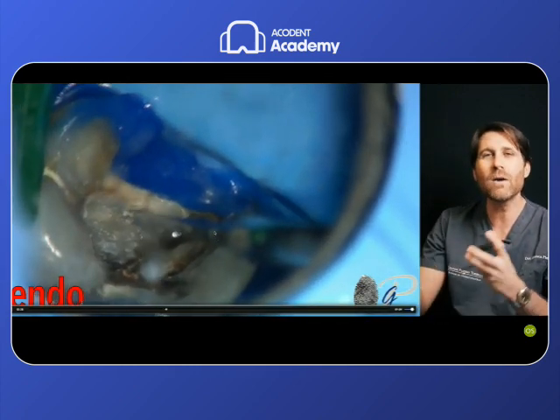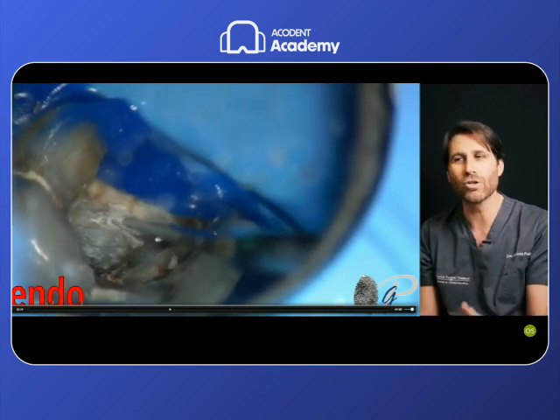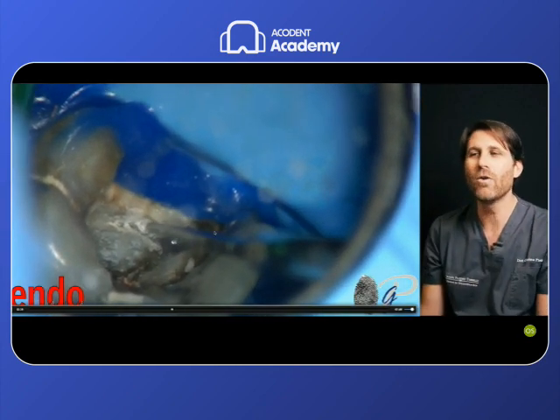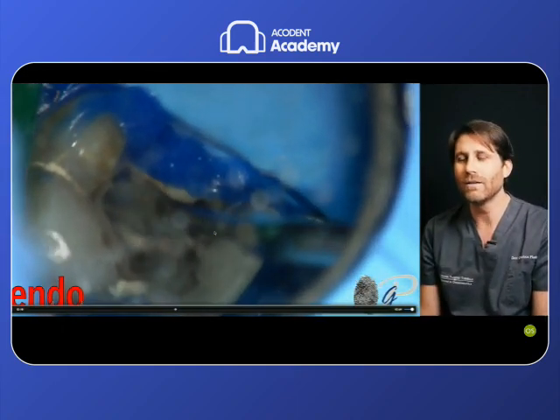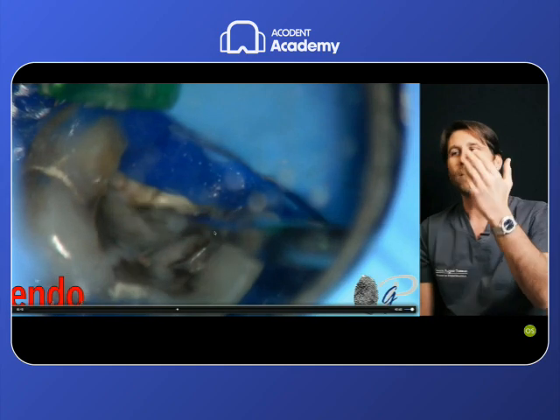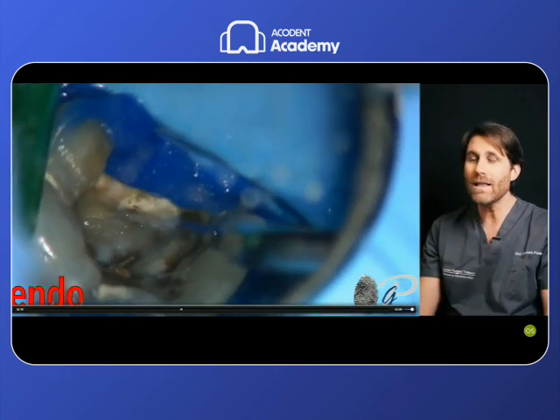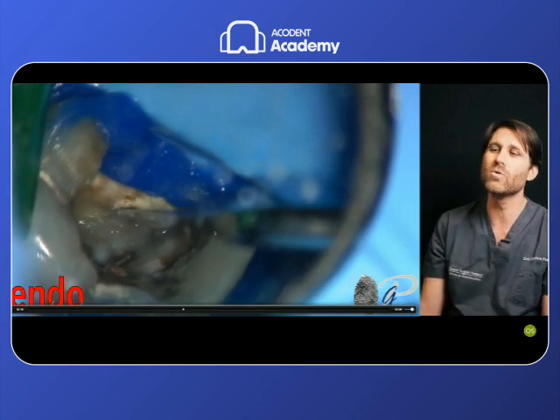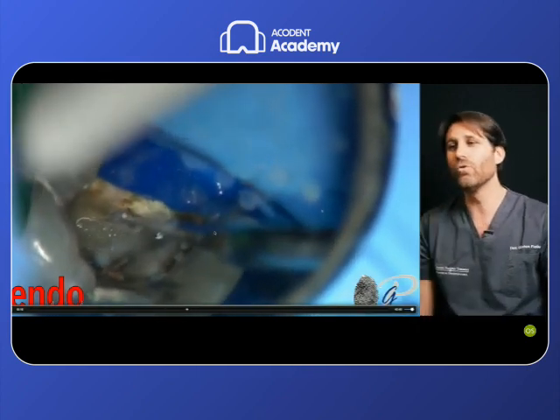So in a dynamic way, as I have insisted very much in my lessons on this endo channel, we go further and then we go a step back if needed to improve the treatment, because the further step was not able to proceed to the next one. So again, we tried mechanically to be more conservative, it was not able. Then we took our ultrasonic tips to go deeper inside the root.